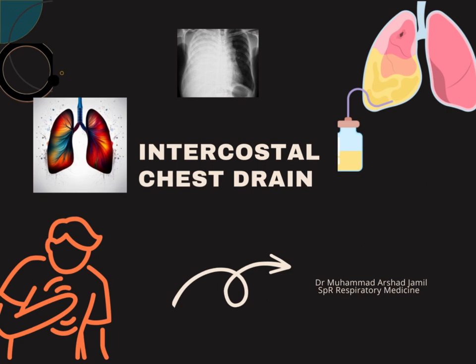We are bringing you a pretty important topic: chest drain insertion, its indications, contraindications, and various steps. Hopefully, this will be very beneficial for you practically and academically. So if we can just bring up the next slide. I've prepared some important slides for you guys.